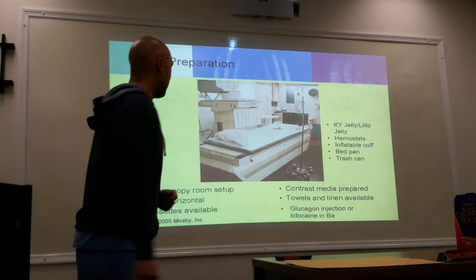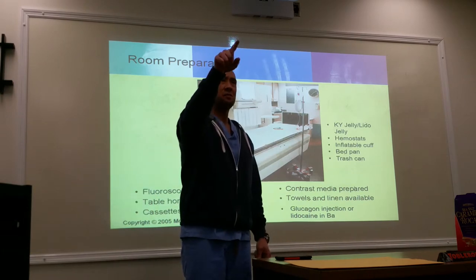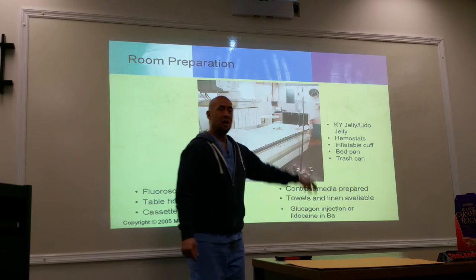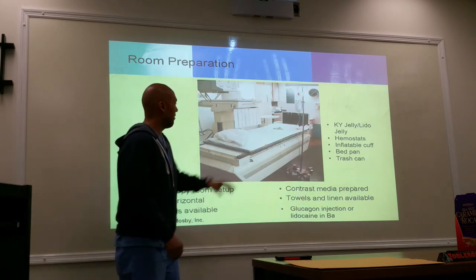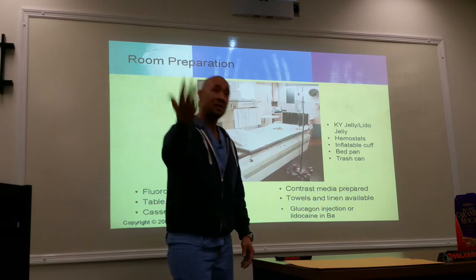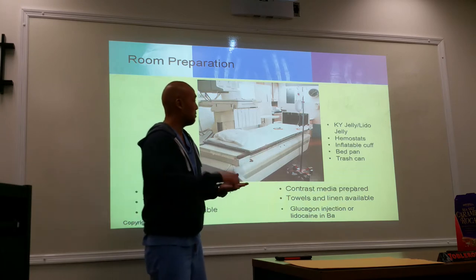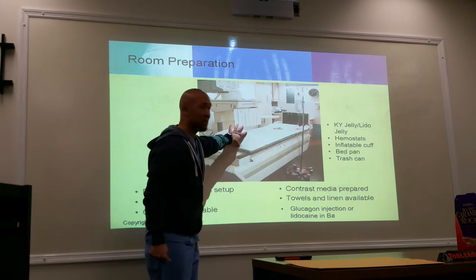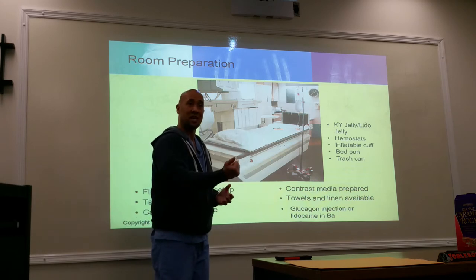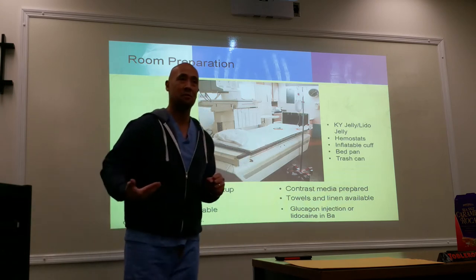Okay, room preparation for barium enema. Make sure the footboard is intact. Another thing that you will see technologists do: if there is a pad on the table, what do you think is going to happen when the table stands up? It's going to slide. The pad's going to slide, the linen's going to slide. So one other thing to consider when doing things like an upper GI and esophagrams, especially a BE, is to tape down the pad at the top to the table. Not all the way underneath where the table mechanism is, because when you're moving the table, the tape is going to rip. So make sure it's just at the edge of the table, not underneath the table mechanism.